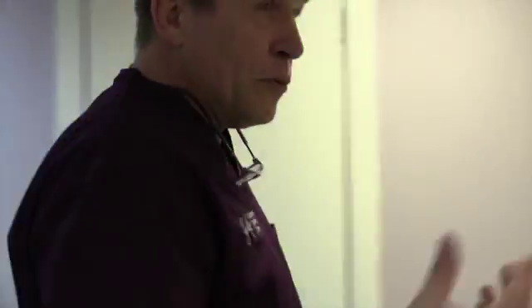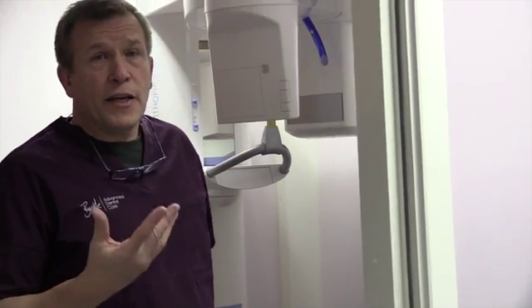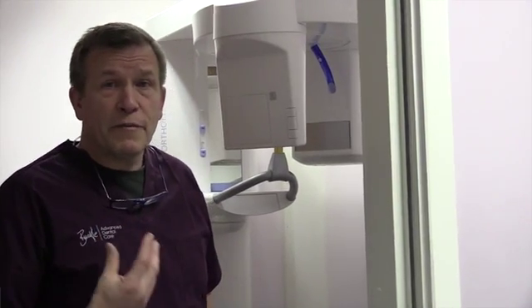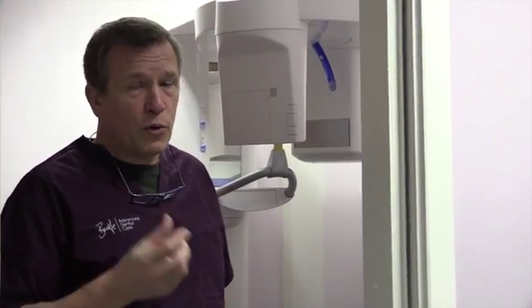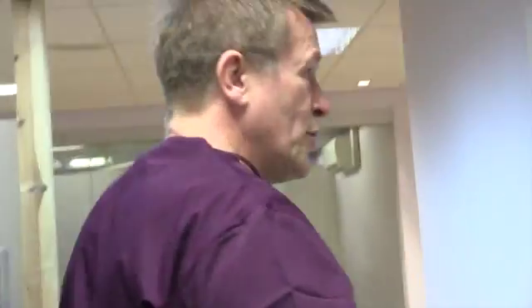We're going to be looking at how we use our CBCT scanner in our practice. Obviously from all our implant work, we're going to use that in connection with our intraoral scanning, and then we can do a virtual wax up, and from that virtual wax up we can design where the tooth needs to go, which then drives the position of the implant. And then if we want to, we can also make a stent that's going to drive where that implant needs to go. So let's go through to the surgery and the treatment room, and I can show you some of the scanners that we're using on a daily basis.